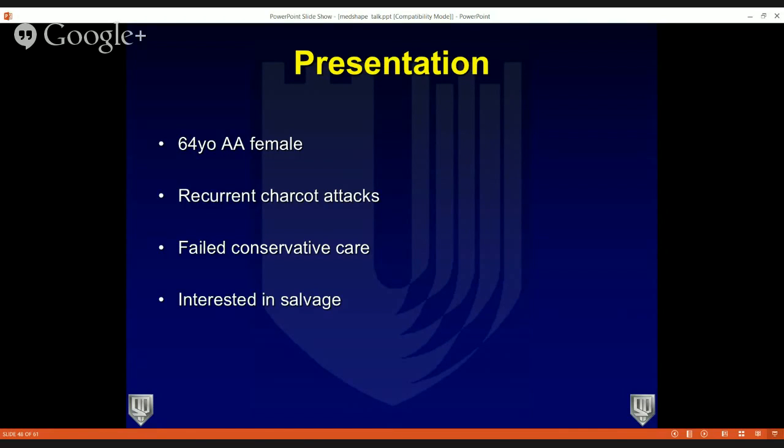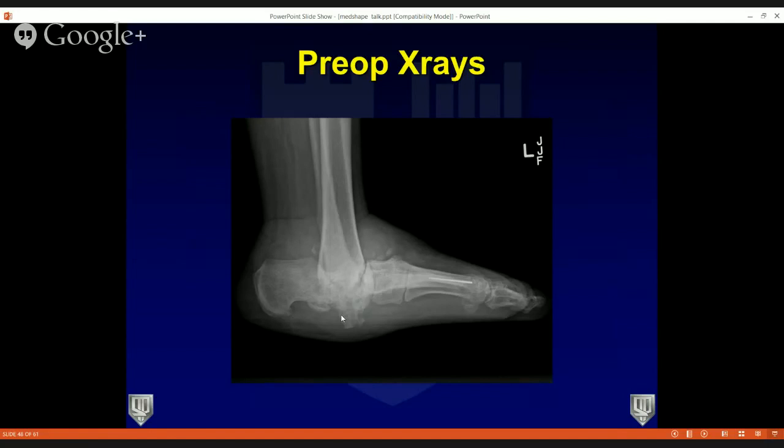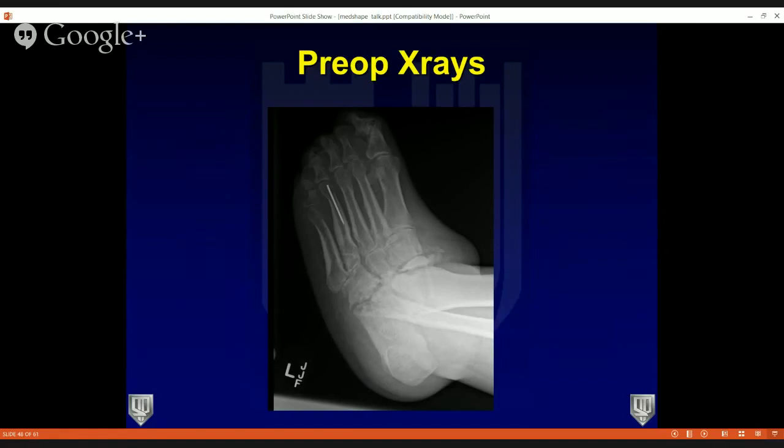Here are her preoperative x-rays — this does not look normal. On the AP something's going on at the ankle; the lateral shows the talus is half resorbed and the other half is sitting plantar, almost poking through the plantar surface of her foot — pretty extreme. On AP and lateral weight-bearing views of her foot, the navicular is almost resorbed and the calcaneo-cuboid joint doesn't look healthy either. This patient has significant disease with significant resorption, loss of height, abduction deformity, and valgus deformity.